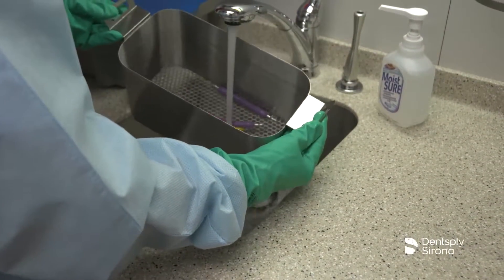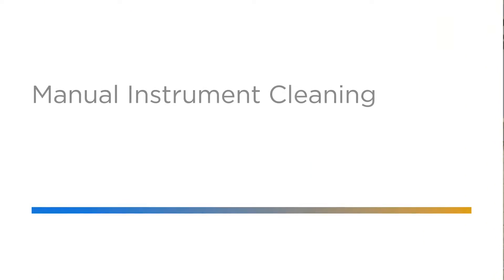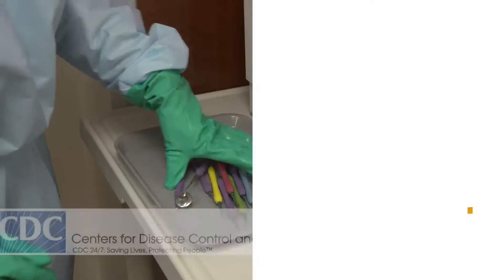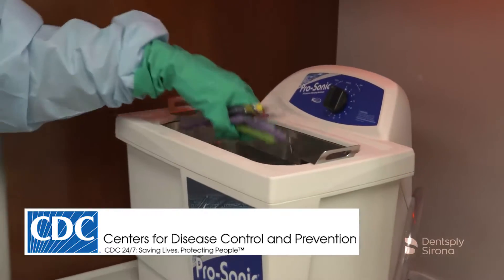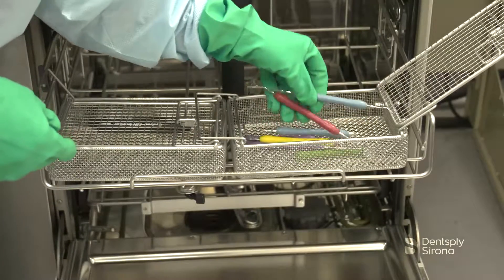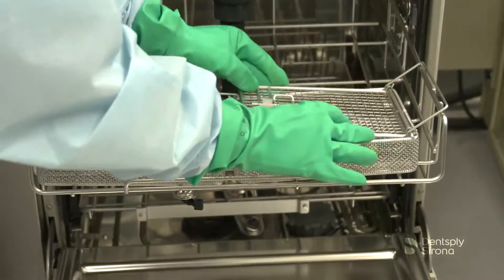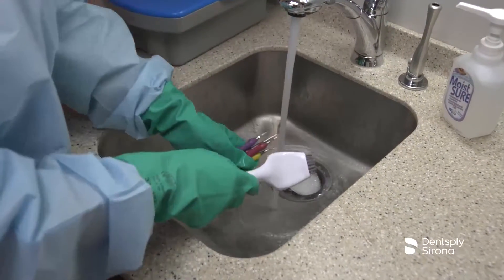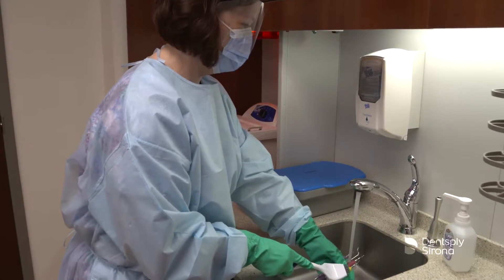Instruments should be cleaned prior to sterilization to remove all bio-burden and debris. The CDC recommends the use of automated cleaners. Manual cleaning and scrubbing should be avoided to reduce the risk of injury or exposure to the clinician. When an ultrasonic bath or automatic instrument washer are not available for instrument cleaning, manual cleaning is then utilized. Instruments should be scrubbed low in a sink at arm's length utilizing a long-handled brush with a surfactant or detergent under running water.